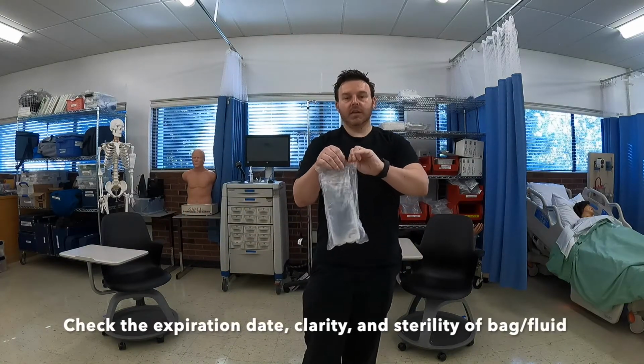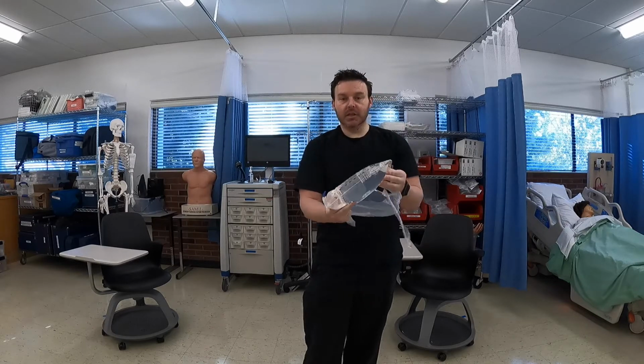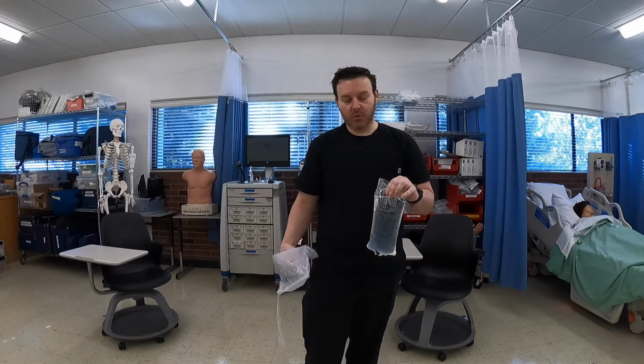So I'm just going to go ahead and rip just like that. And again, you want to make sure there's no leaking, nothing going on. And then of course it also has a barcode up here. Again, it's a medication, so we're going to scan this as well.